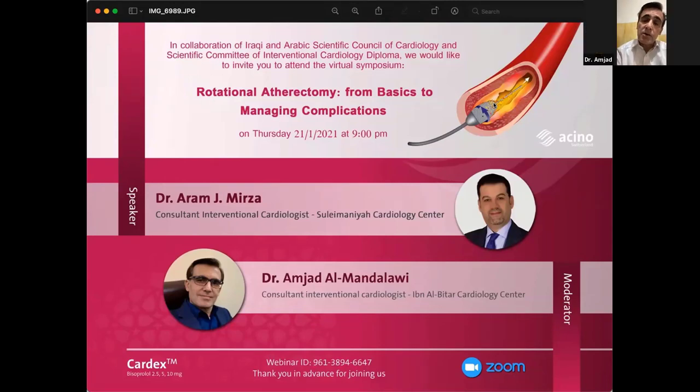I think you are right when you're talking about the cost and working in the private hospital. But here, when we have a non-dilatable lesion, we can talk on the table to the patient that we can continue the procedure. But now comes the problem: in a non-dilatable lesion, what burr size are you going to use? Initially, you can use a small burr, but if the lesion is not dilatable, then you have to use a larger burr. And with the larger burr, you have to change the guiding catheter. So there are some complexities when you do rotational atherectomy after balloon dilatation.